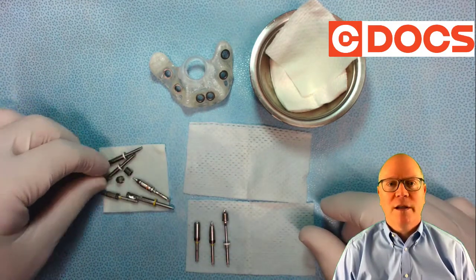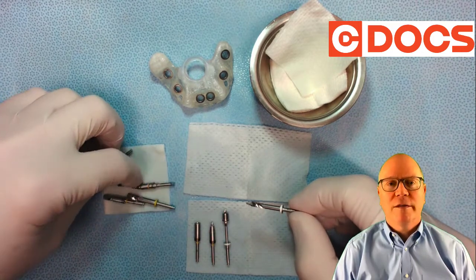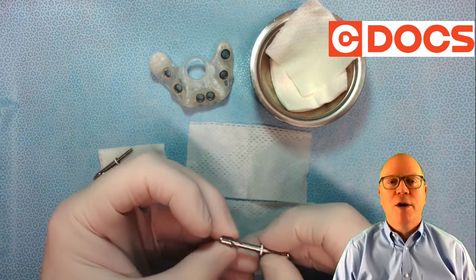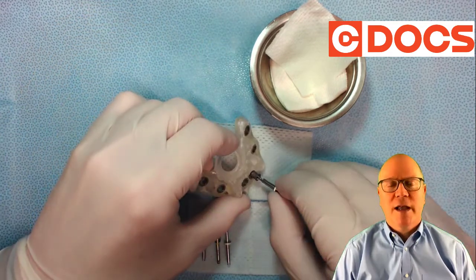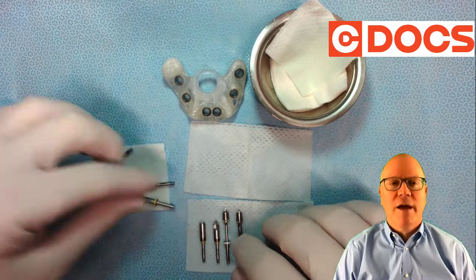So everything's organized. Next comes the number three. Put the appropriate sleeve on that, right near the tip, always just as how I'm going to use it in the surgery. Check it again in the guide, because these can get mixed up, and you want to make sure you have everything organized.